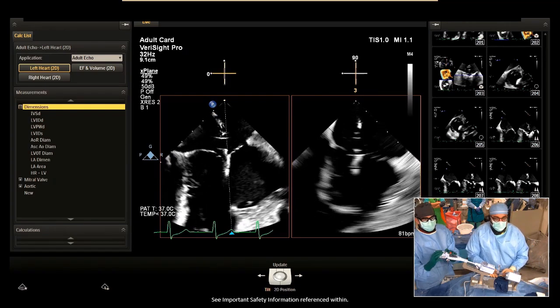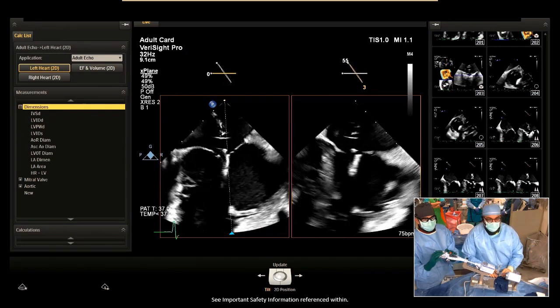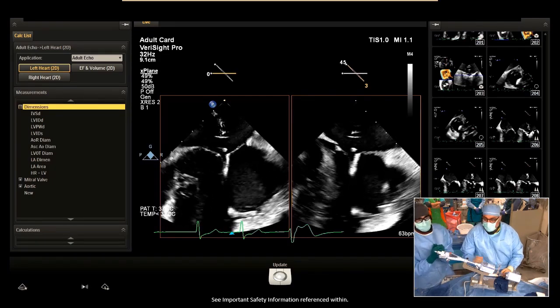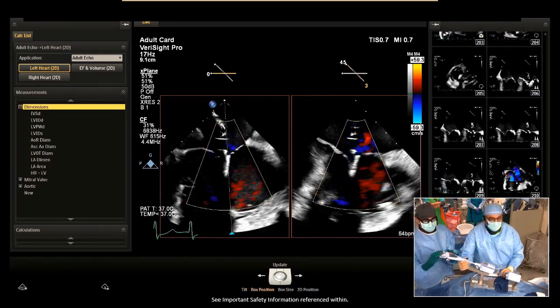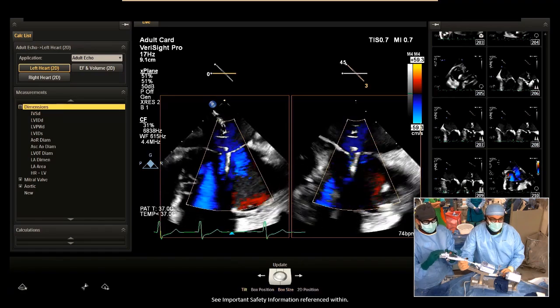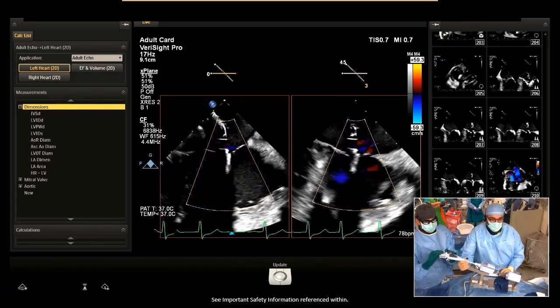Okay. 60? Yeah. There's or 45 even, yeah. Okay, good. So now put color on and we'll tighten. Color's on. Good, so go ahead and tighten. Tightening here. Yeah. Okay, we're max tight, Edris. That's good there.